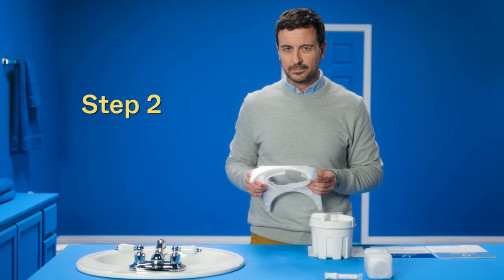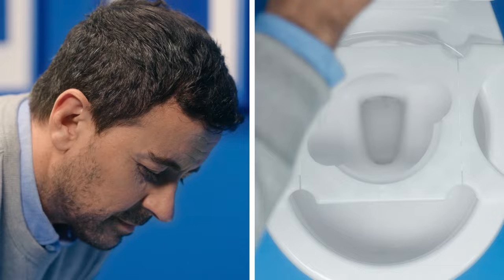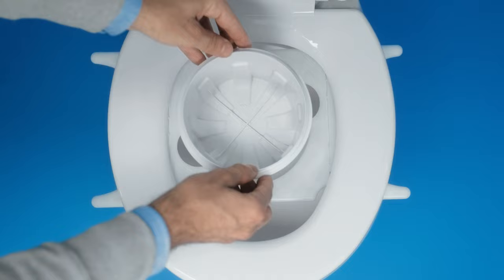Step 2: Raise the toilet lid and seat. Unfold the bracket and place it on the toilet rim toward the back. Lower the seat onto the bracket. Can you see the opening? Unscrew the lid of the large container and slip the container in the bracket.